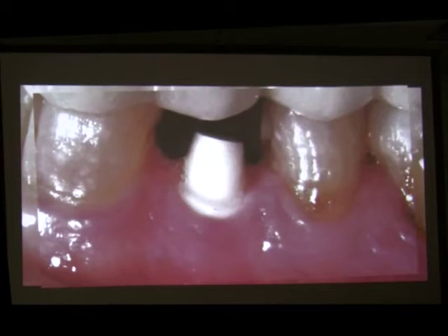Yes? Is it okay to just submit the coping on the day of the surgery and let them walk out like that? Coping, it's too much occlusal surface for the patient to bite on. So we prefer to go with the smallest portion of implant coming out through the gum. So in case the patient doesn't wear the Essex for chewing, there will be less surface contact for the patient to bite on. So we prefer on the day of surgery, Essex and no coping on the implant. That's what you asked, right? But you could shave the coping down so that it doesn't occlude. Yes, exactly. You could cut the coping and have it completely hollow, and just put the coping where the abutment portion is. But I don't think in this type of patients it gives you any advantage. If you have gum covering the margin, you can trim it 4 months post-op.